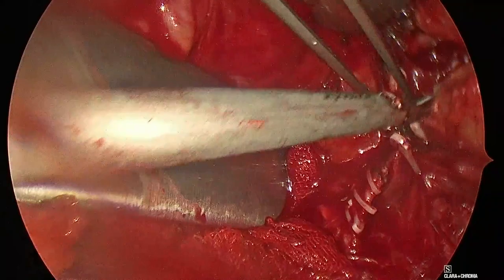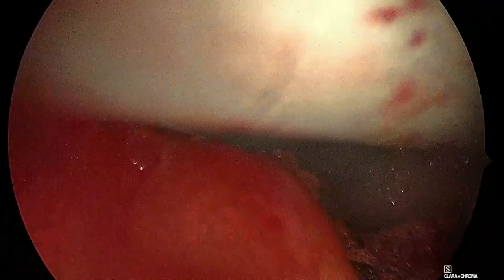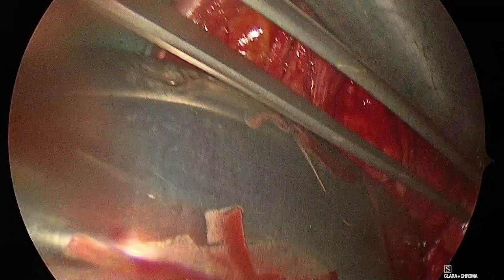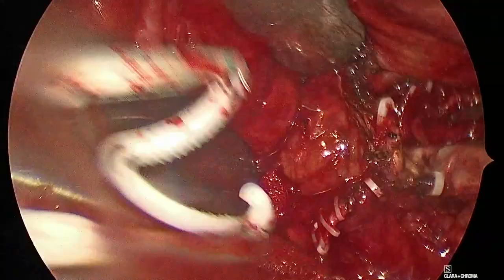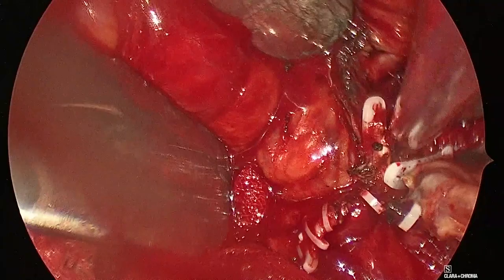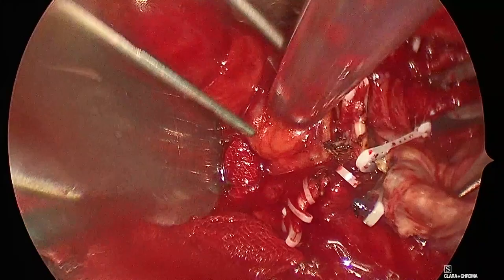So this is the end of the tumor. Give me a hemolock now. Yeah. Big one, eh? Okay, so now we place a clip in here. Okay. And now the back. Suction out. Okay, so now we see the ureter there.